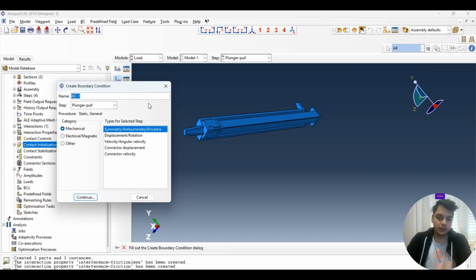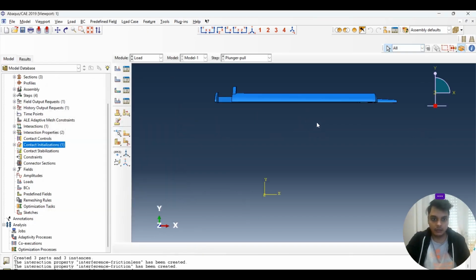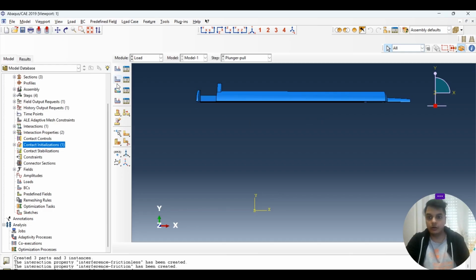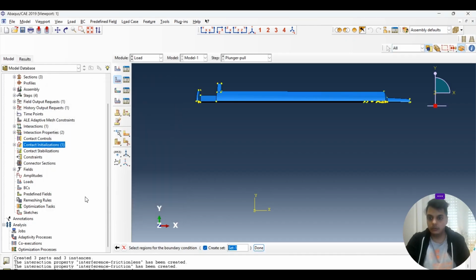So let's say this part is symmetric. Initially I have to understand what type of symmetry I have right now here. So here we can see we have Y symmetry as well as the Z symmetry. So accordingly I have to define these boundary conditions. So Y symmetry, and just simply go to the symmetry part. So here also I can say Y symmetry center.